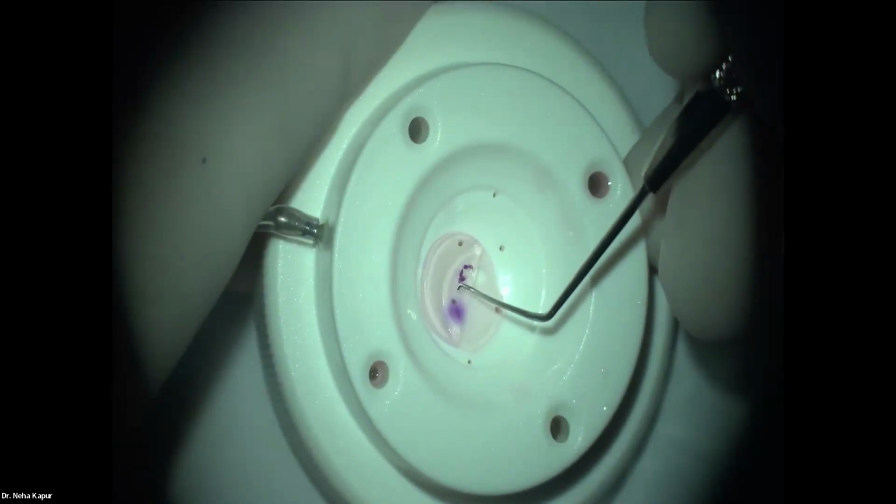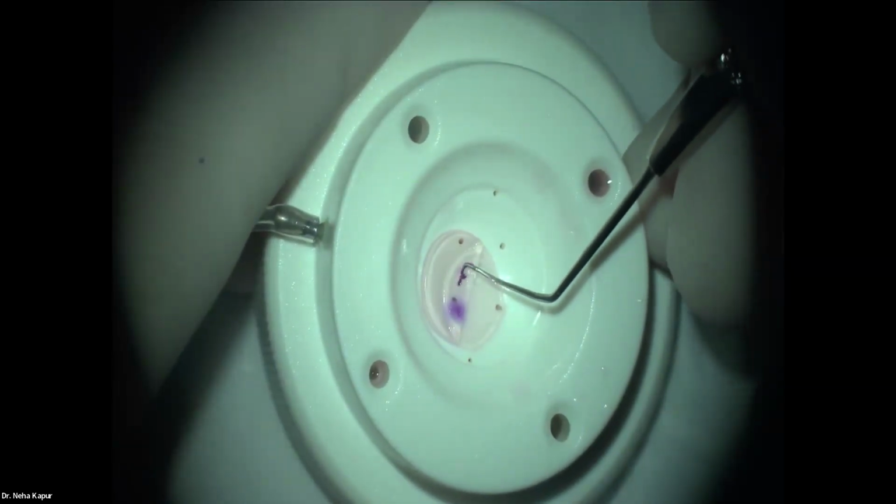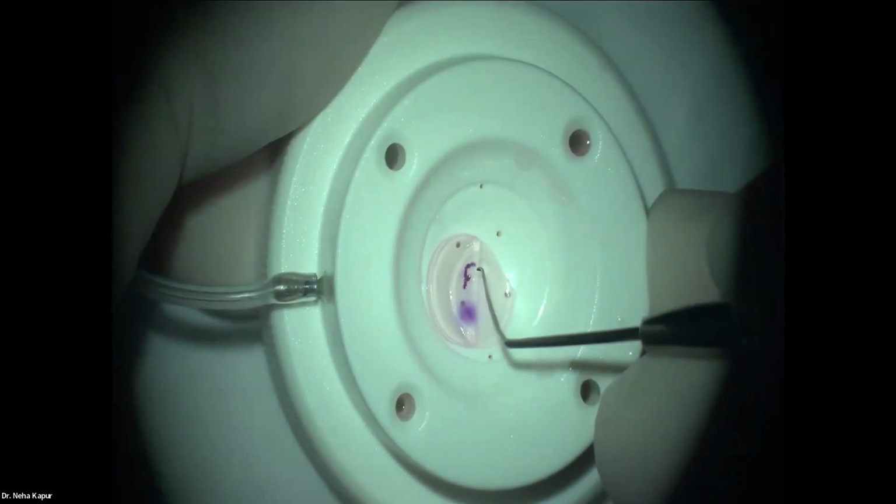So have a clear mark which shows the orientation of the tissue in the eye.